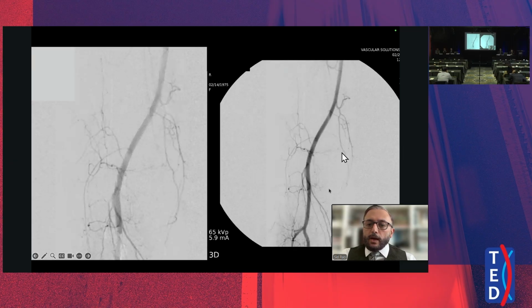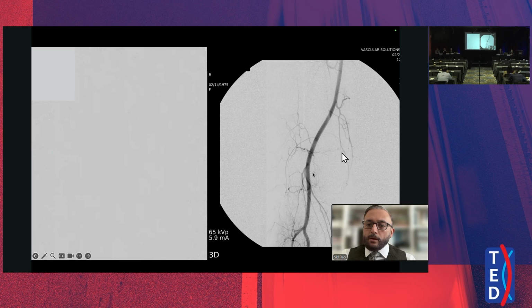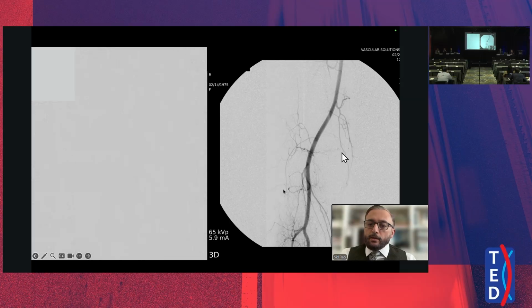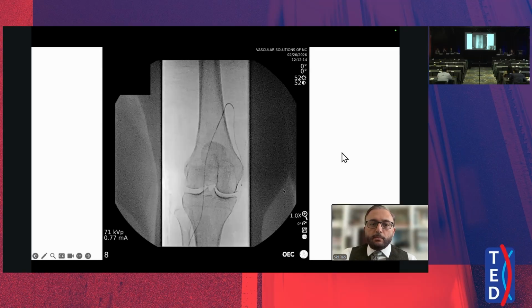So what about this one? Take a look at this. This is what we call the scout shot. We take an initial sort of lay of the land. And where in the world is the inferior lateral coming off of? Is it coming off of this common branch? Is it coming off of this double density? Is it coming off of this sural branch and then going this way? So these things can be a little challenging.